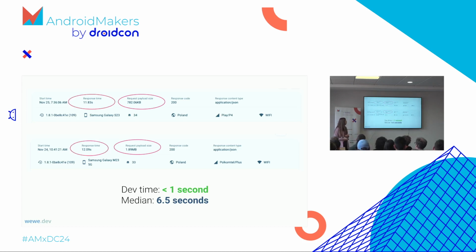Here you have the response time. It doesn't look good. And here we see that users were using Wi-Fi. I thought that was due to our mobile data transfer, but it's not. So what I discovered is that a Wi-Fi connection doesn't guarantee that the user has a good internet connection.